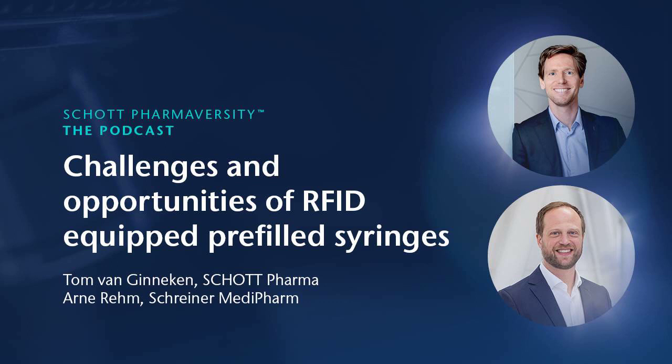It has been used for many, many years, and for many different applications besides the ones mentioned by Tom. For example, inventory management for all kinds of goods, such as clothing, managing the restocking and maybe even the checkout in a shop. Identification of animals: you very often see these yellow tags in an ear, very often equipped with an RFID tag. Access control is something we all cope with when we go to work and stamp into our work, but we also use it at the gym or parking lots, etc. There's a lot of things we interact with through RFID in our daily life. And if you're traveling, your passport is also equipped with RFID.